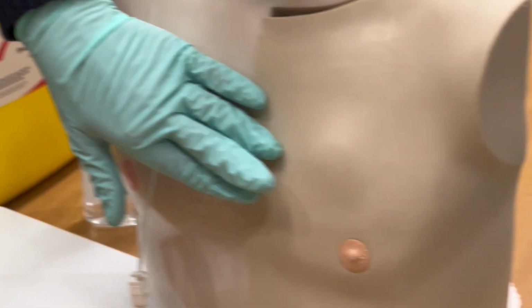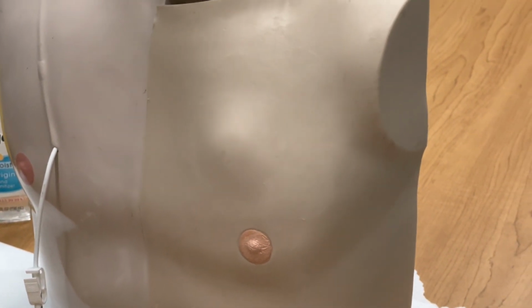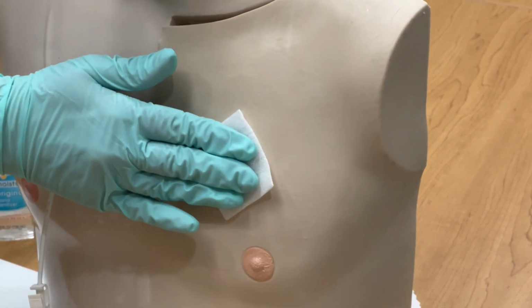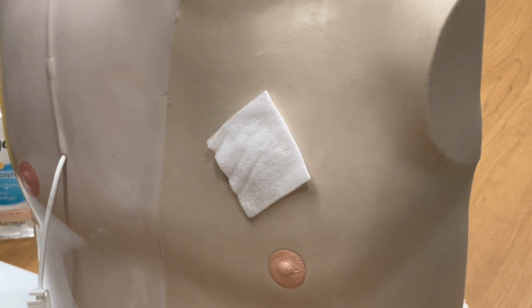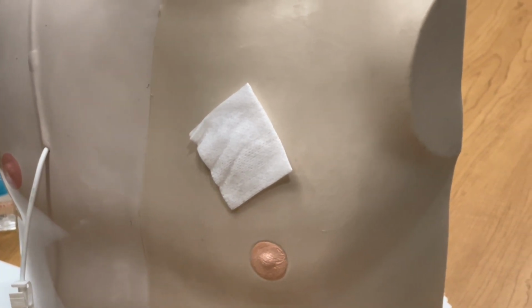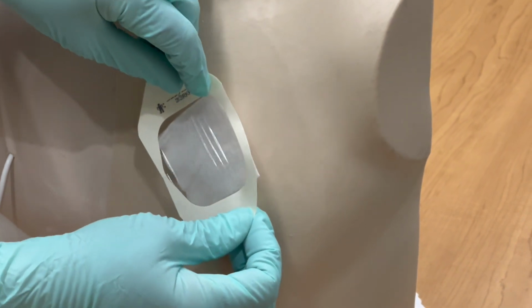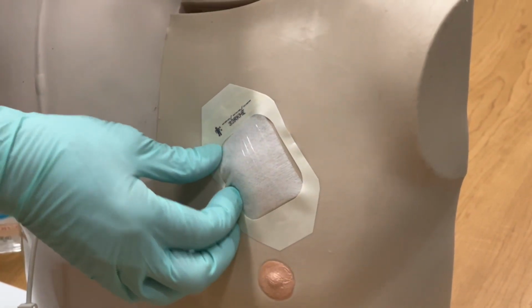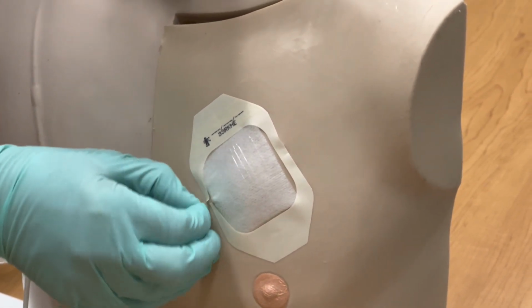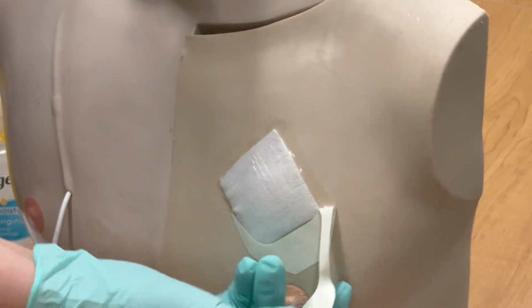Sometimes you may see a drop of blood on the port site. That's normal. You have a piece of gauze in your kit and you can just apply pressure until the bleeding stops. Otherwise, you can take the little piece of Tegaderm out of the kit and cover the site with the dressing. You can leave this on for a little while, but you definitely want to remove it within 24 hours or sooner if it gets wet.